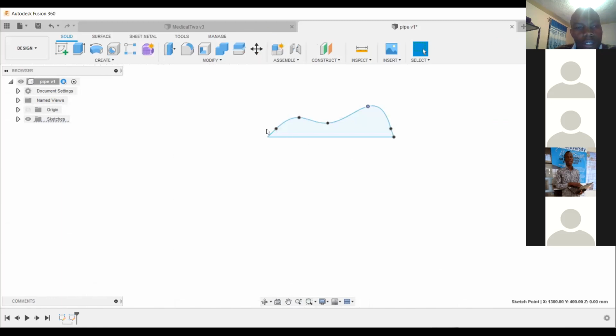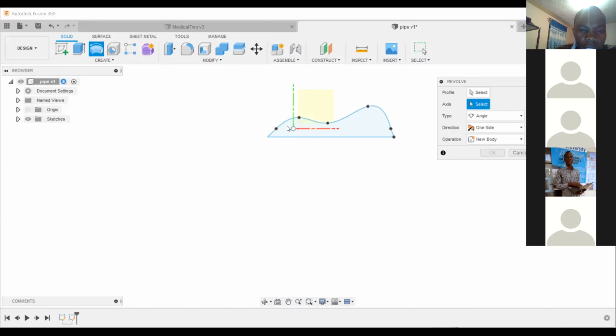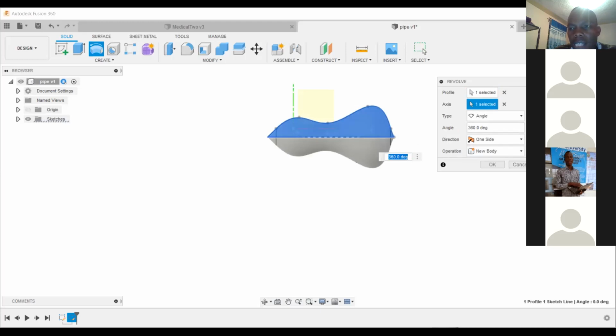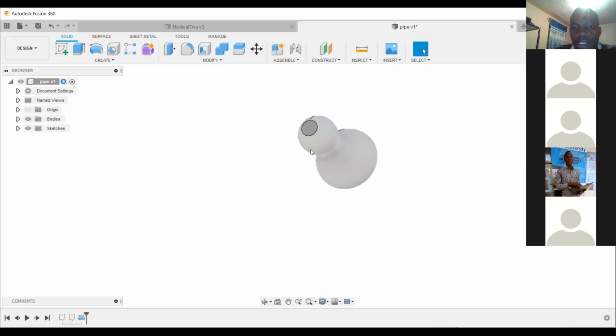Then you finish sketch. Then you come to create, revolve. Then select profile, you select this. Then select axis. You can select the bottom one. Then this is how it's going to look. You can put the angle there to be 60, so it will look something like that. Looks like a knob.